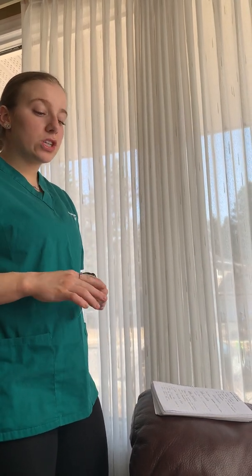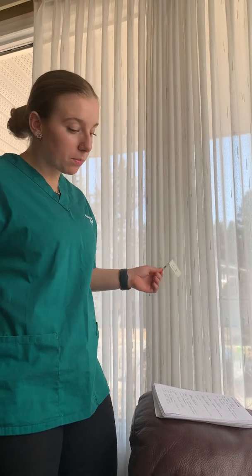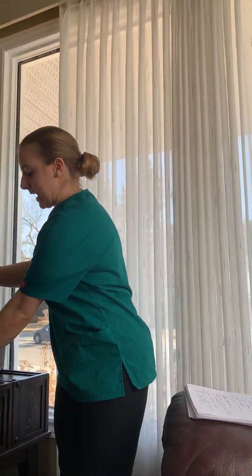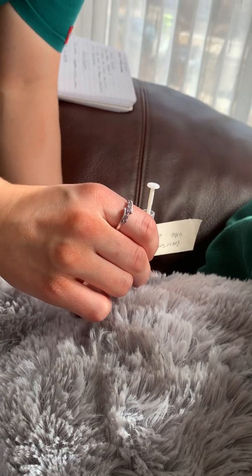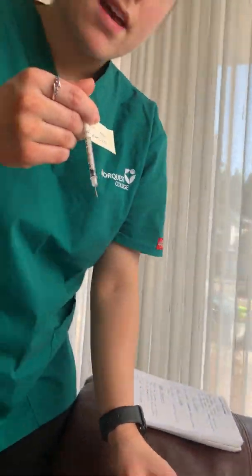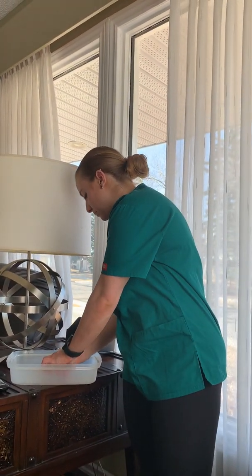I will take my Humulin R and I will let the patient know that they may feel some stinging, but it'll go away very fast. As they know, they're probably used to this. Never assume though. And then we will remove the cap. Place the cap there. For subcutaneous, we want to pinch the skin and insert at 90 degrees. And then inject the medication. Take it out at the same angle you put it in. We want to scoop the needle back into its place.